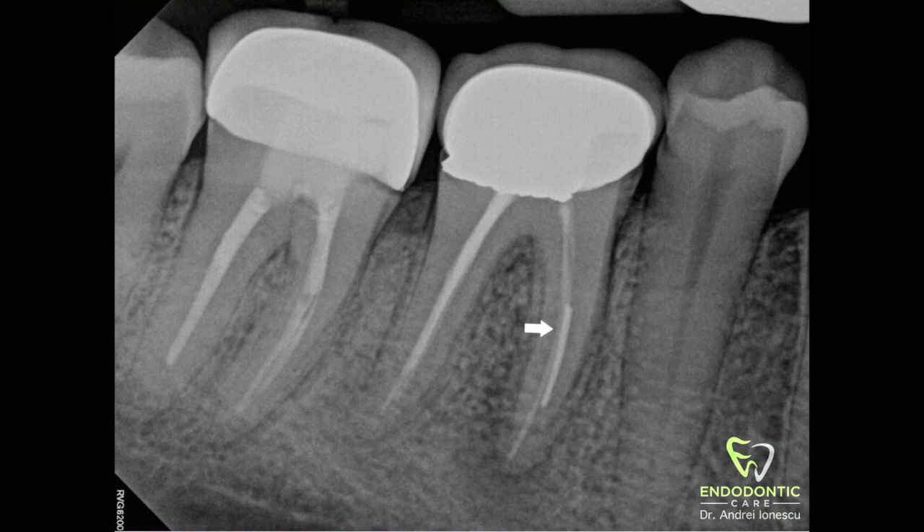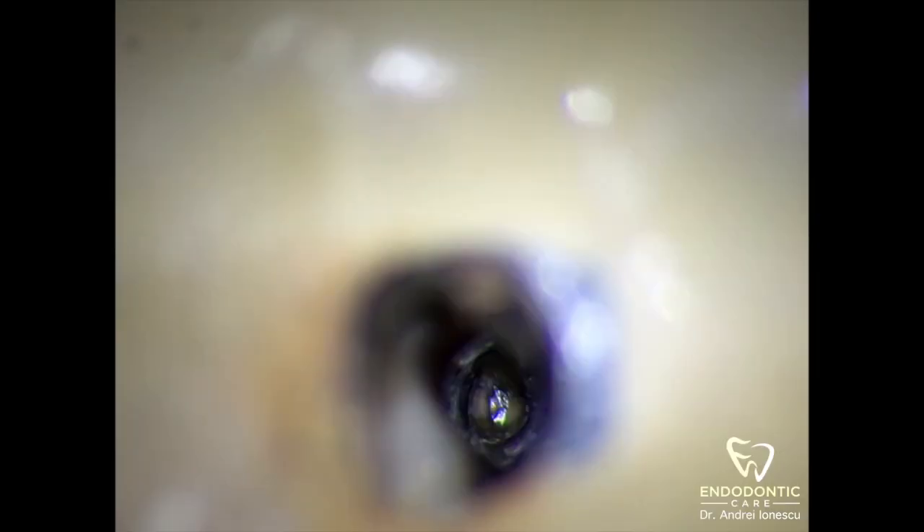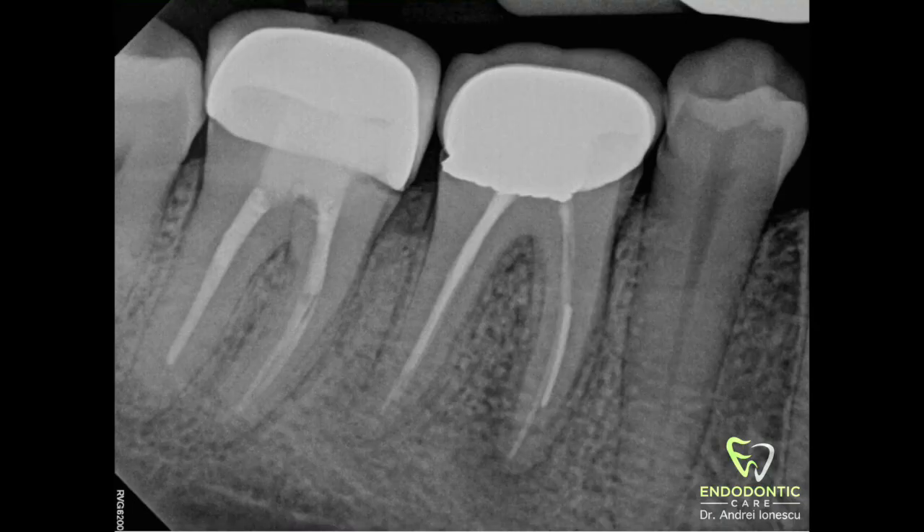Before we get into it, I just want to say this is not an easy procedure. This file is deep inside the canal and it's wedged in there pretty well, which is why it broke off in the first place. If this is something you're not comfortable tackling, then refer the case out or call your endodontist for help.